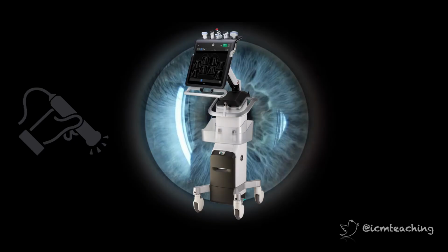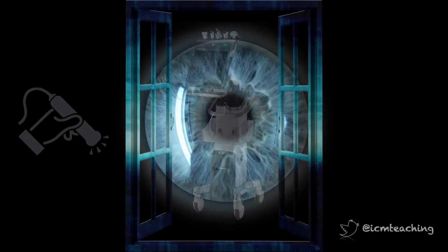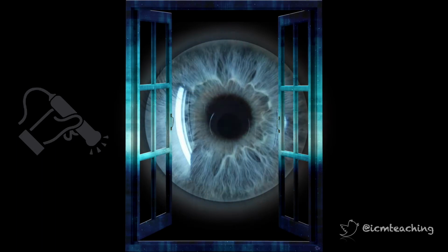Ultrasound of the optic nerve has been generating a lot of interest in recent years. Ultrasound gives us a window into the brain, whether it be transcranial Doppler or optic nerve assessment. The idea of having a non-invasive imaging tool you can use at the bedside to help decide if someone has raised intracranial pressure is very attractive.